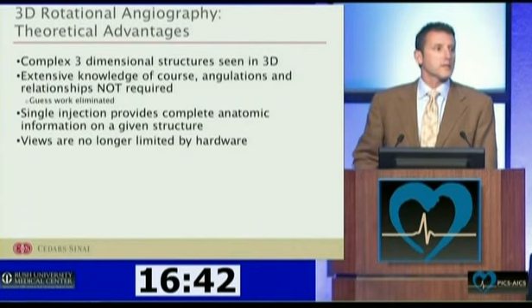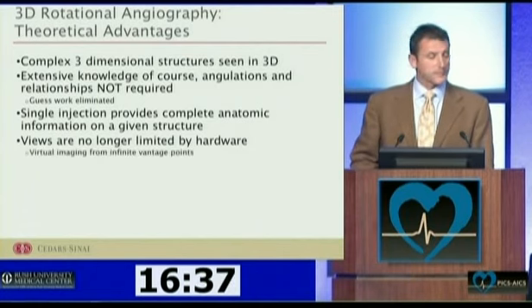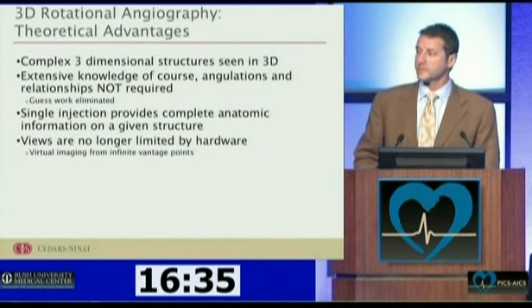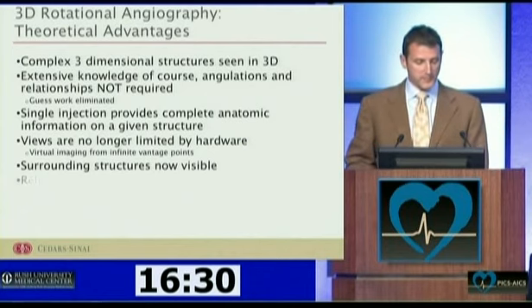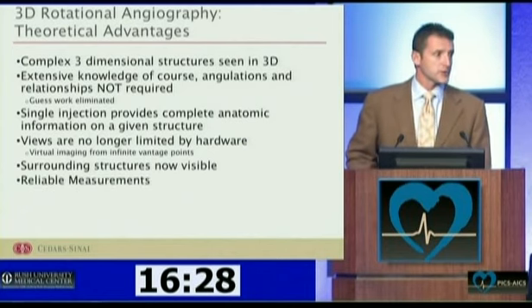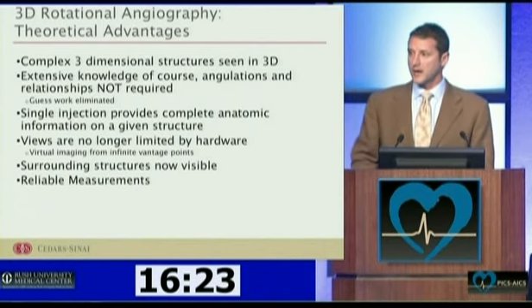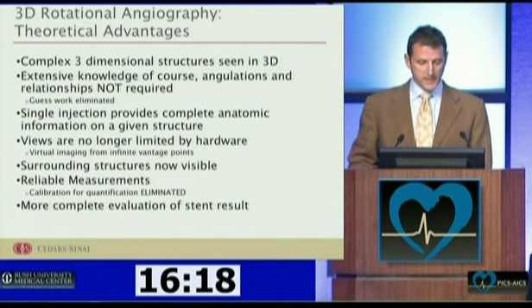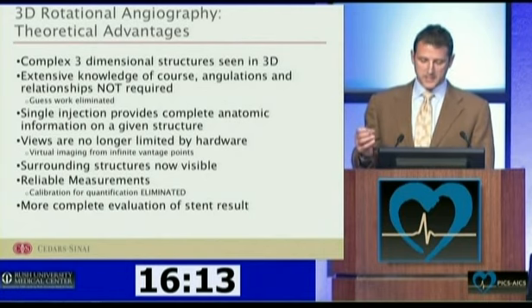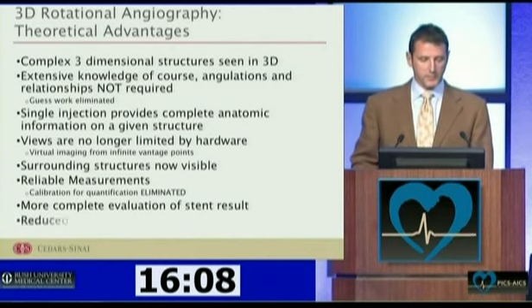Views are no longer limited by hardware or people in the room or the patient themselves. You can virtually get imaging from infinite vantage points. Surrounding structures, as we've seen so nicely demonstrated, are now visible, and reliable measurements, measurements that aren't based on how good you are at tracing a catheter, can now be made. Calibration is virtually eliminated with this technology. And I think 3D perhaps doesn't get enough credit for the ability it's going to give us to evaluate our interventions, particularly stent interventions, after we perform them.